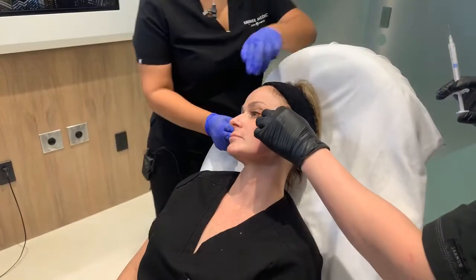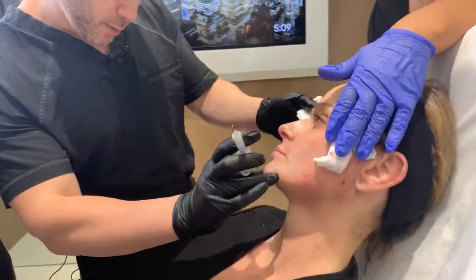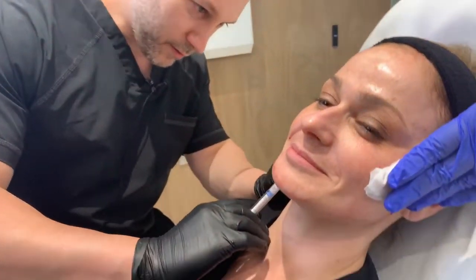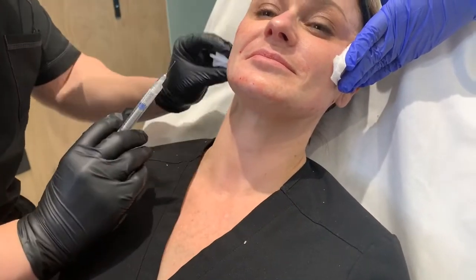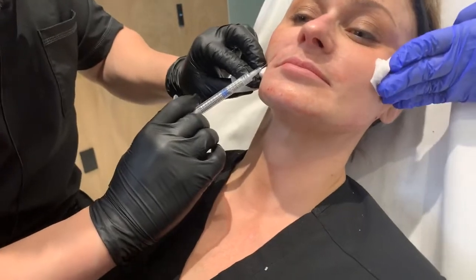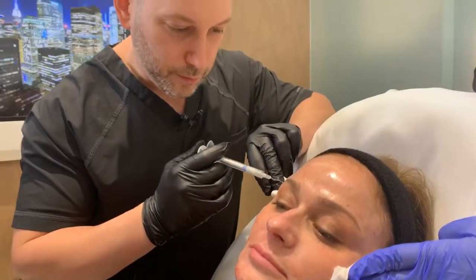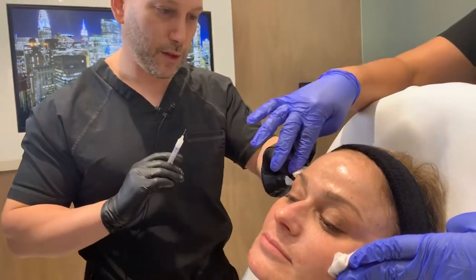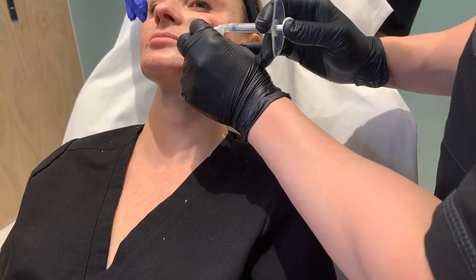Hold right there. Switch of view. Great. Turn over this way. Perfect. Just a little bit more laterally. Good. And today she'll look a little swollen. Tomorrow she'll be so happy. A little bit more to the fold here. Great. And a little extra, so why not? Teeny bit extra in the temple here. Okay, hold there. Good. And this way. And then a little bit on this side, you move a little bit more into the apple.